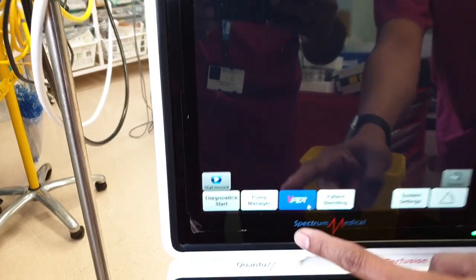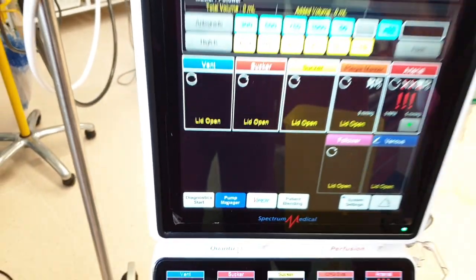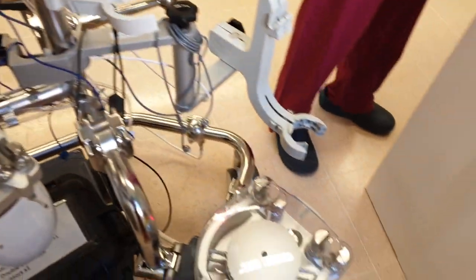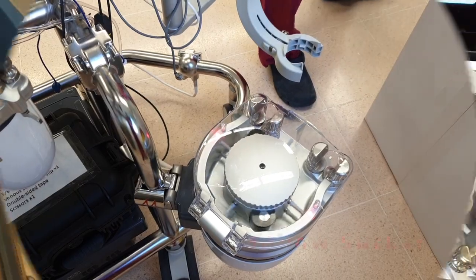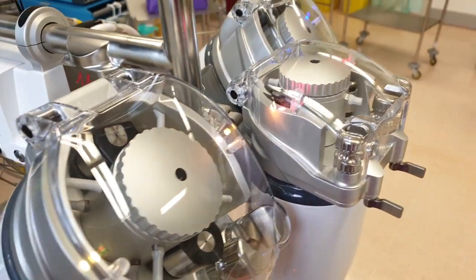Yeah, and then we need to look. Push the pump manager. And you're ready to go. And that's the arterial. And if I turn the arterial, that's the one which is running. The beauty of this pump is every module is color-coded.